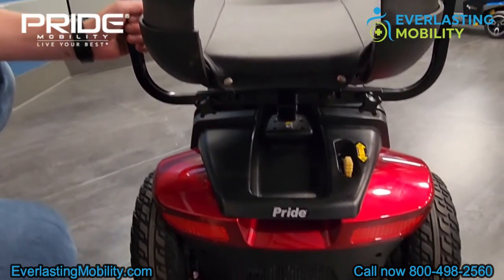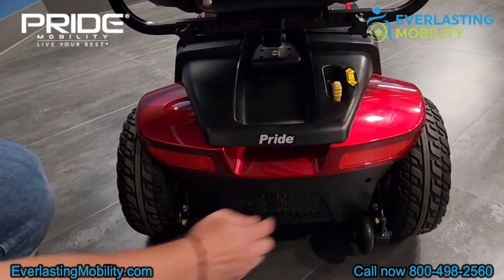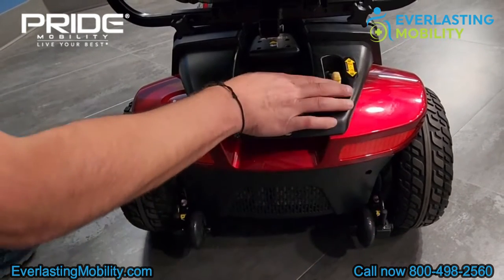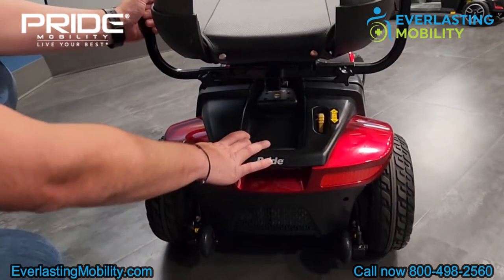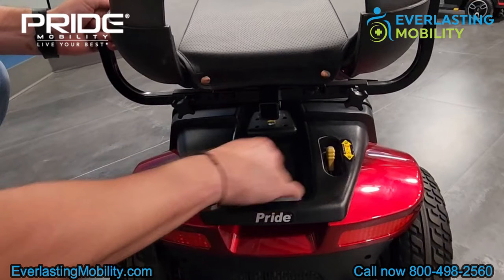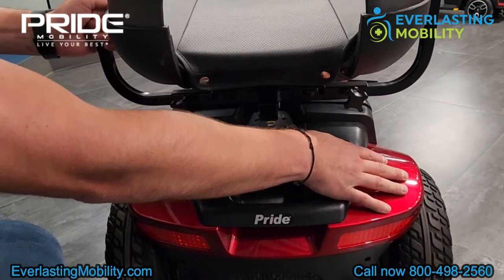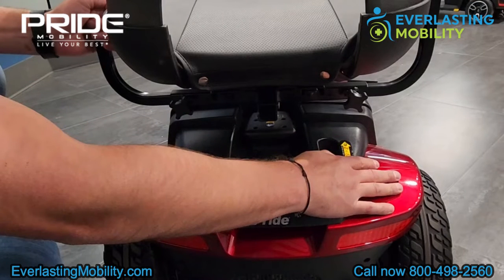On the back of the scooter, there are two rear reflectors so you can be more visible in the evenings. These are your anti-tip wheels for added safety when you're going up steep inclines, to prevent you from tipping backwards. The yellow lever is the freewheel lever. If you press it forward, you can push the scooter because it is now in neutral — useful if you run out of battery life. To operate the scooter, press it down into the drive position, and the electromagnetic brakes will engage once you let off the throttle.